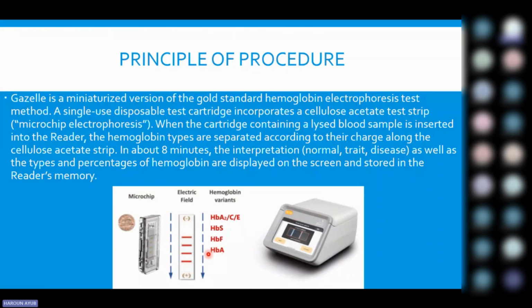In the electrophoresis method, you'll find that we have the negative charge and the positive charge, and these particular variants will migrate depending on the net charges of the individual variants. So the highly negatively charged will migrate further because they are more attracted to the anode and repelled from the cathode. The migration will follow a certain direction, and then the representation will happen.